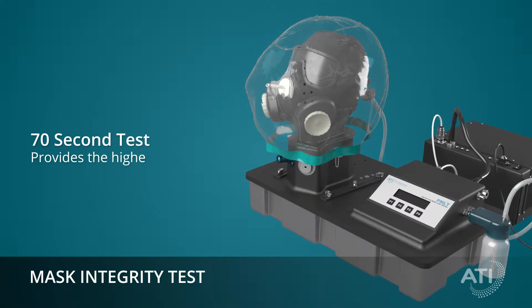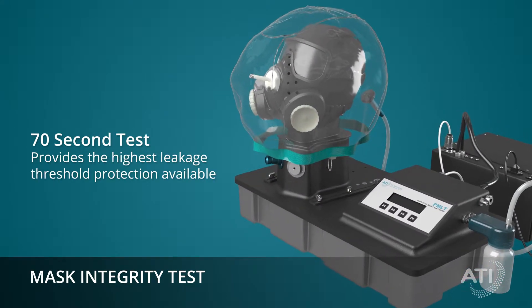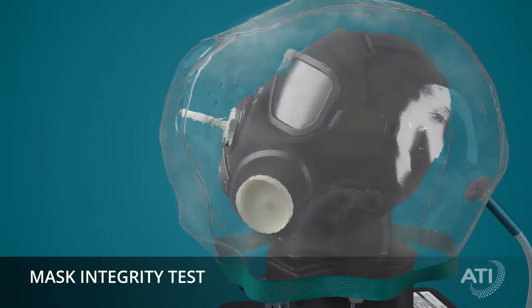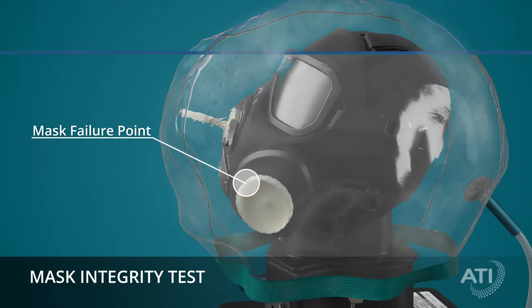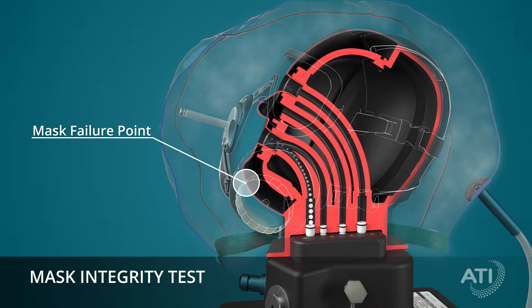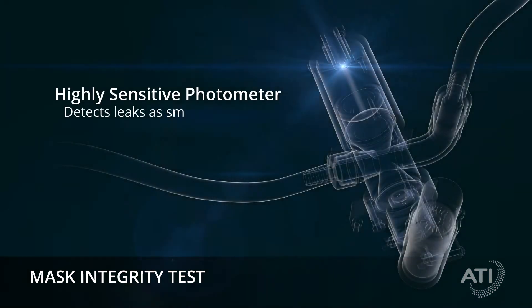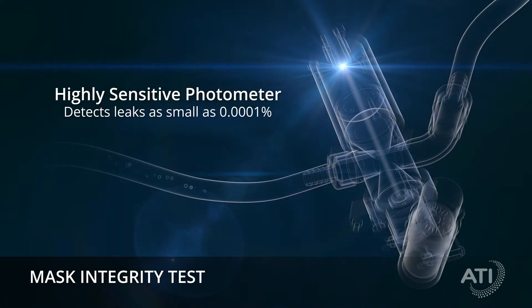In just 70 seconds, the mask integrity test offers the highest leakage threshold protection available. The system creates negative pressure inside the mask, pulling any particle-laden aerosol through failure points into the PMLT, where a highly sensitive photometer measures the mass of particles inside the light scattering chamber, and alarms if a leak as small as 0.0001% is detected.